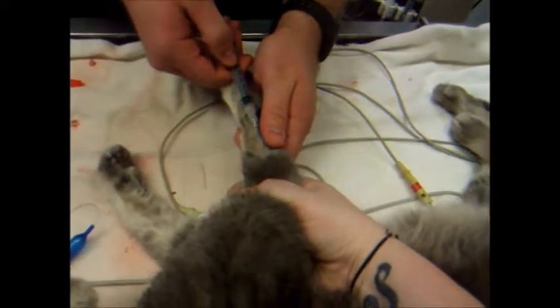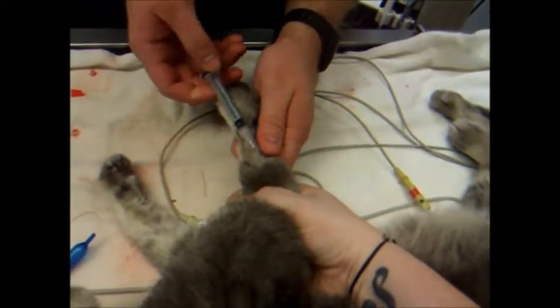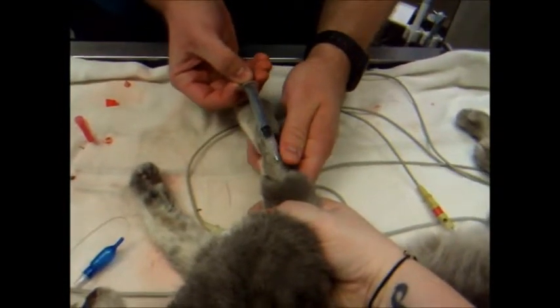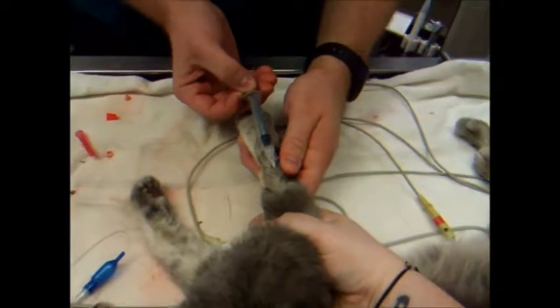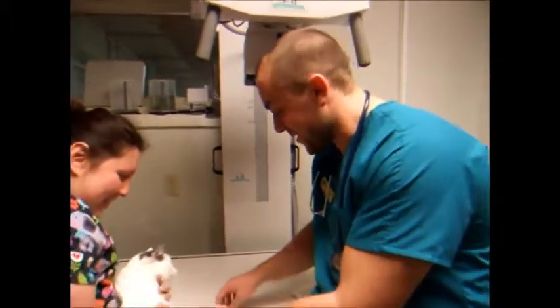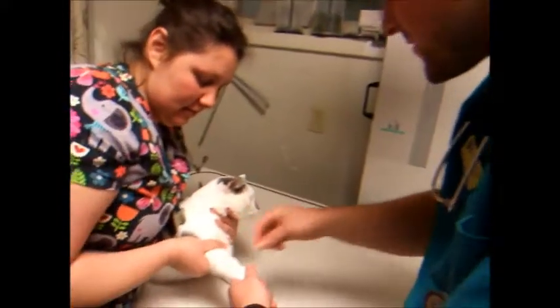Just one more try here. I'm going to go ahead and draw blood from the cat's cephalic vein here.